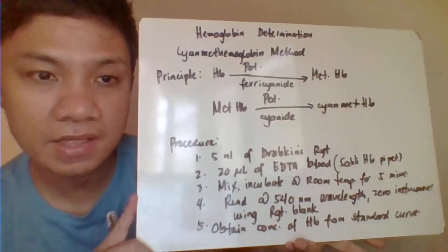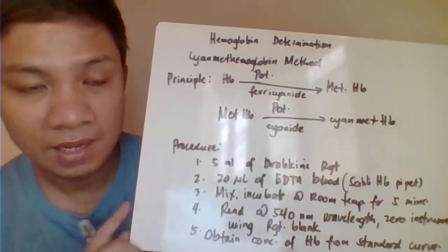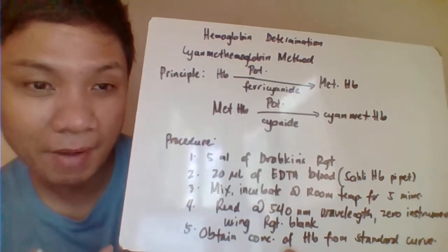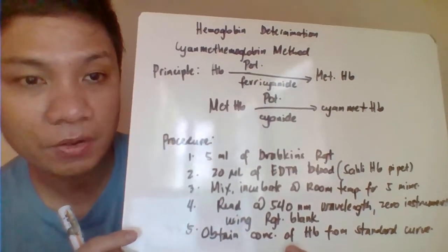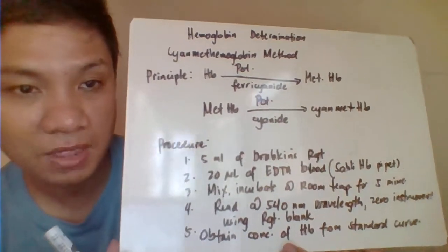Okay, so we have here the hemoglobin determination. Basically, our universal, acceptable, or recommended method for hemoglobin determination, both for the manual or even with your automated instrument, would be your cyan-meth hemoglobin method.